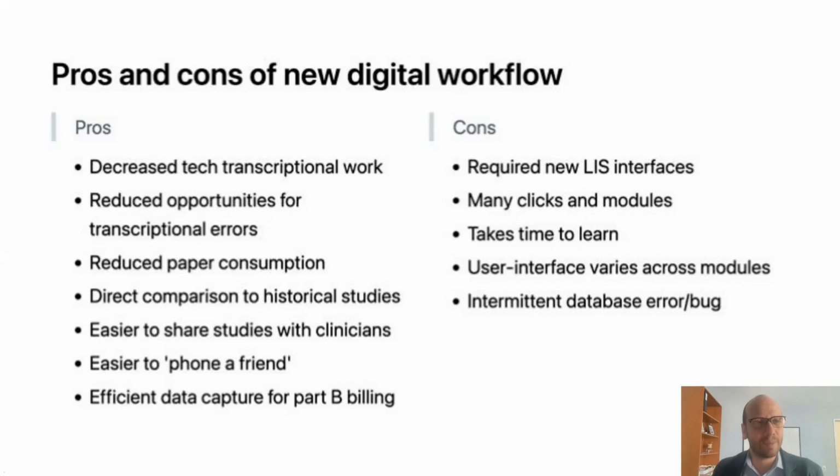There are a couple of unanticipated benefits. Because we're working in this digital environment, it's quite easy to take a screenshot of the study to share with clinicians when they have questions about how we're interpreting a study or a change that occurred in their patients' results. And it really helps them to be able to see what we're seeing to better understand why we're coming to the interpretation that we provided.